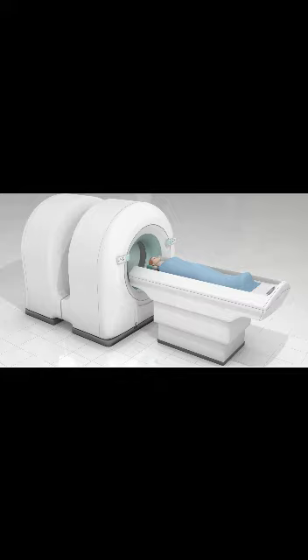Why would you need a PET scan? Your healthcare provider may order a PET scan to check for signs of cancer, including breast cancer, lung cancer and thyroid cancer, coronary artery disease, heart attack or other heart problems, brain disorders, such as brain tumors, epilepsy, dementia and Alzheimer's disease. Will a PET scan detect all cancers?